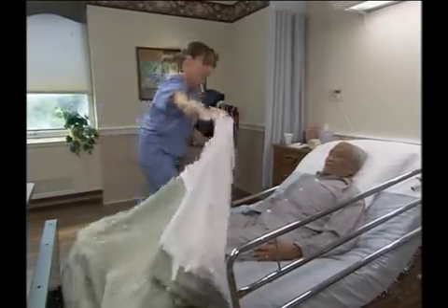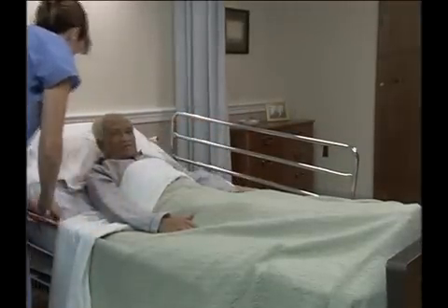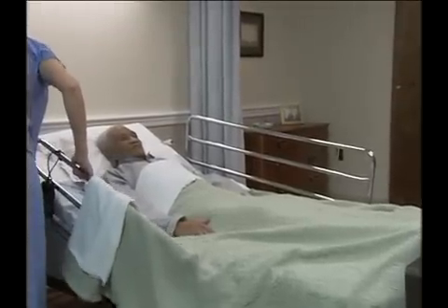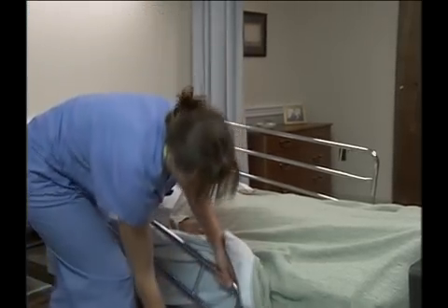Draw the top linens over the person and make sure the call light control is within reach. If the side rails are in use, return them to the raised position. Then, complete your finishing up steps as described in the final section of this video.